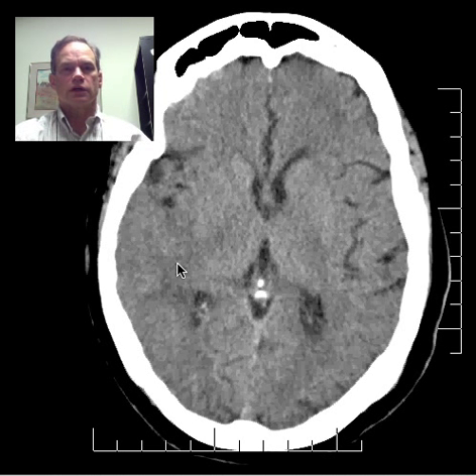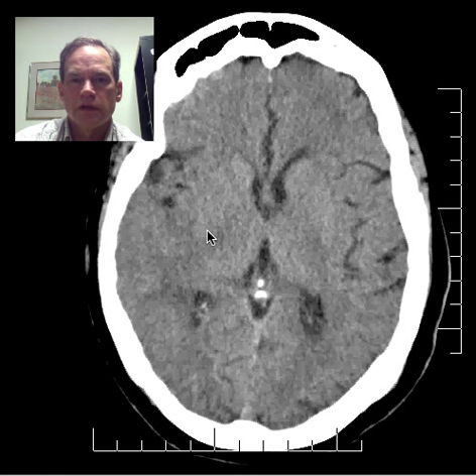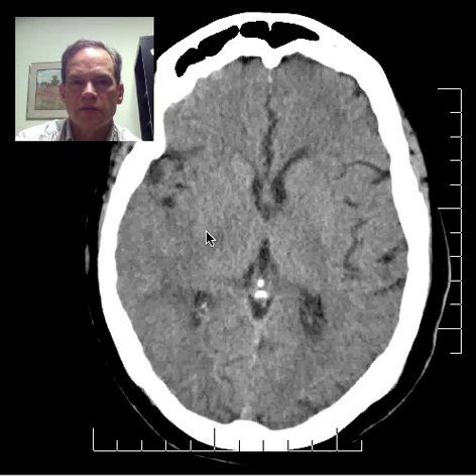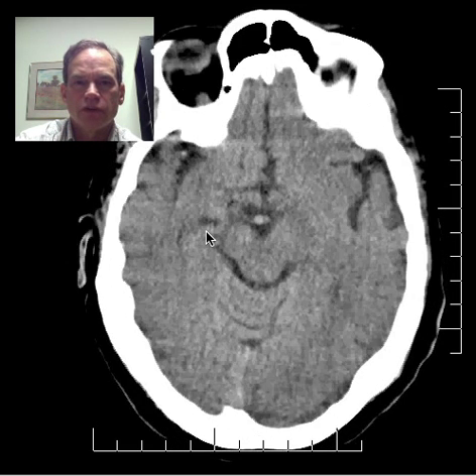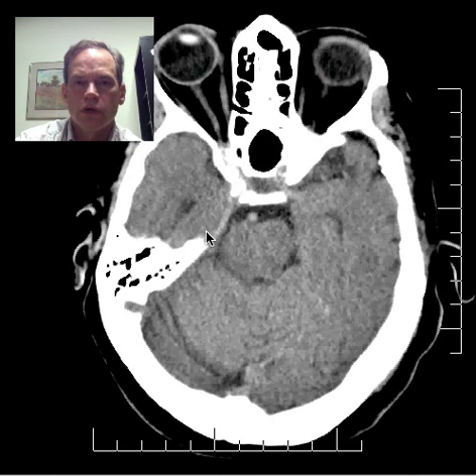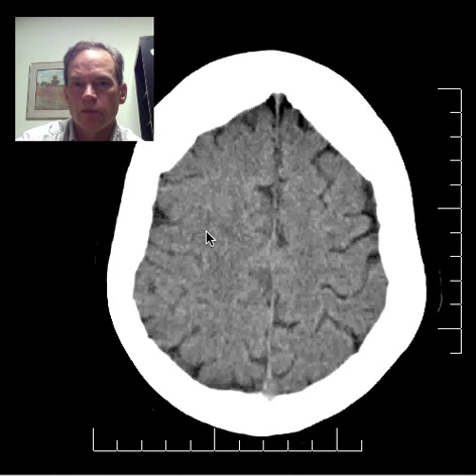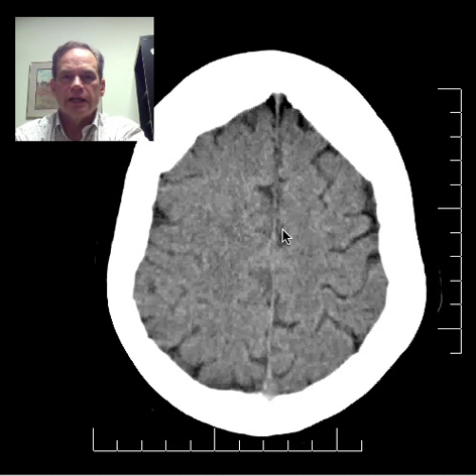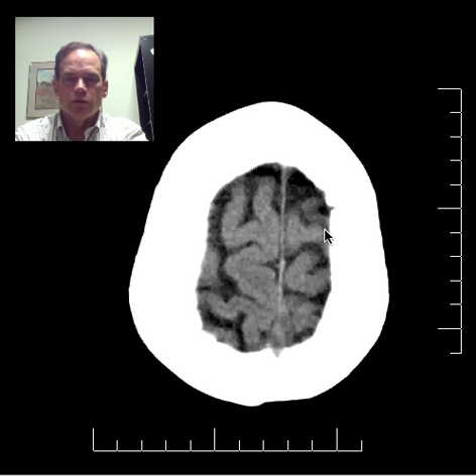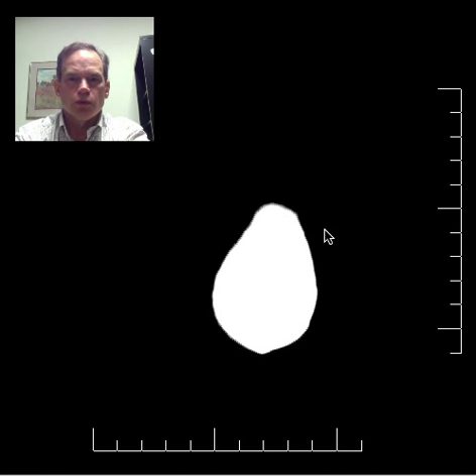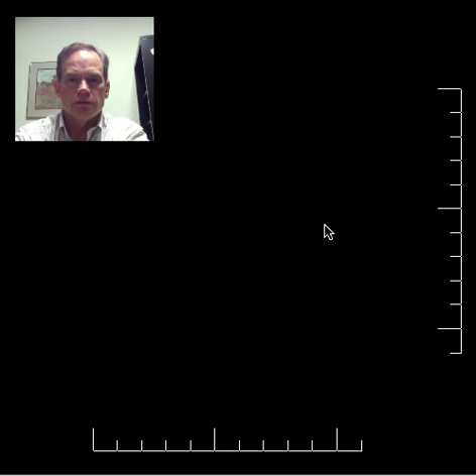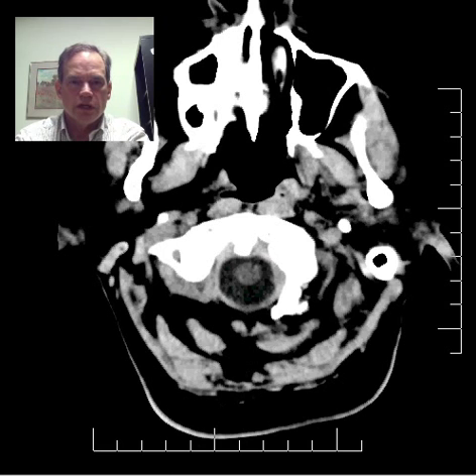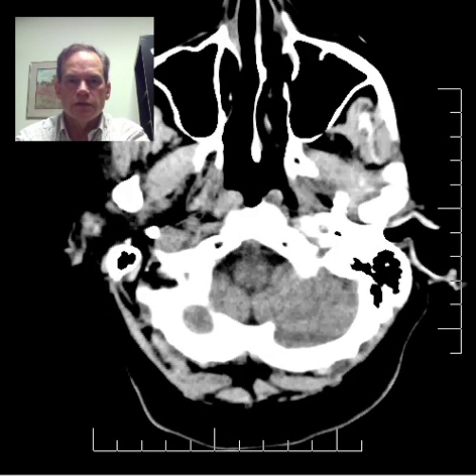This looks like a right middle cerebral artery distribution infarct. Any time you have an infarct, you need to ask whether there's associated hemorrhage, because hemorrhage in infarcts is fairly common and changes the type of therapy. Looking here — is there any hemorrhage? No, there's not. No hemorrhage.